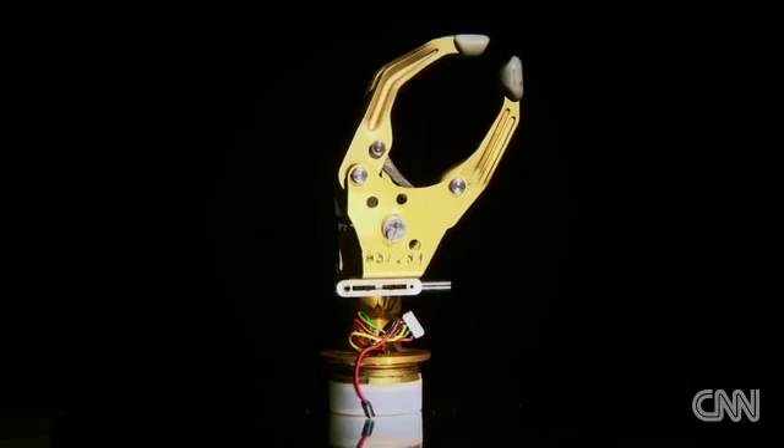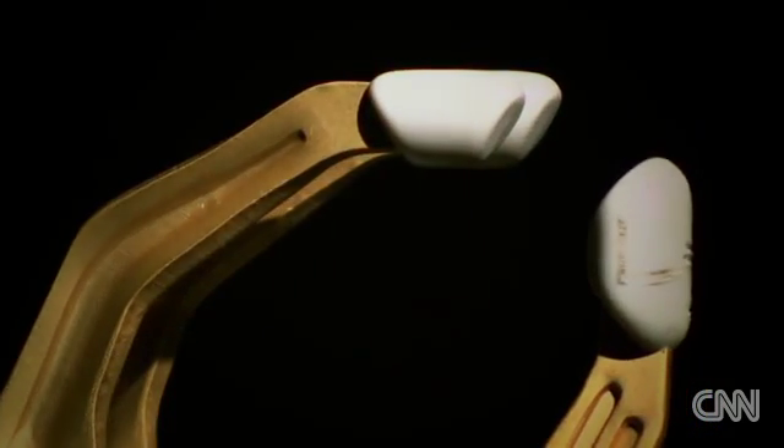The old generation of electric hands had what I would call — if I can use my hands here — a pincer grip, where these fingers are pre-flexed so they don't change shape, and the thumb is one shape, and they move in one plane. A claw.